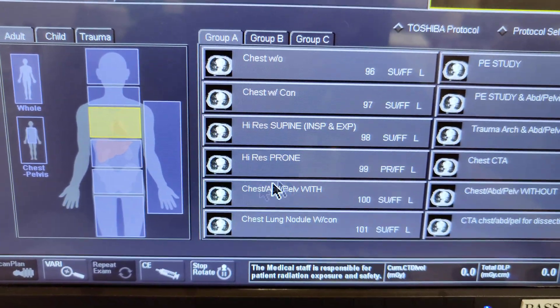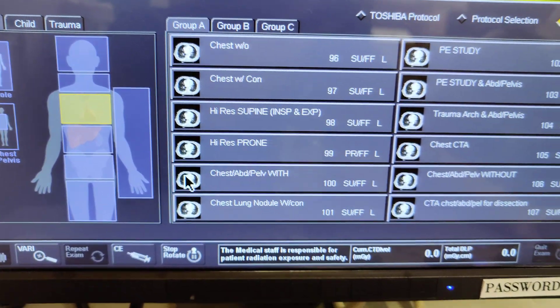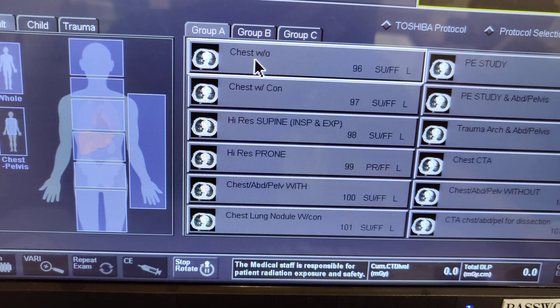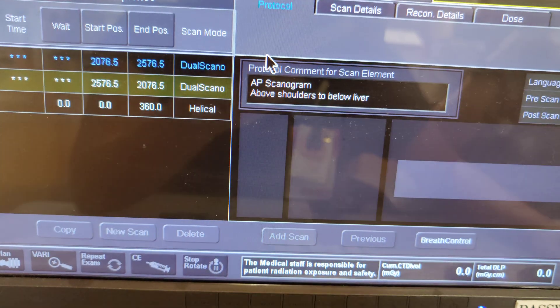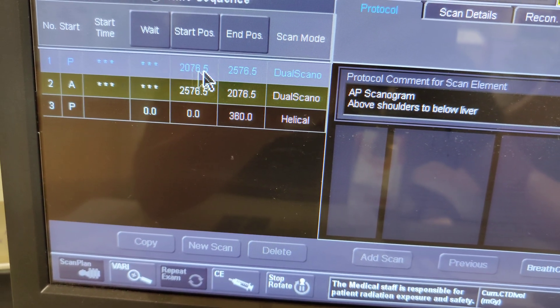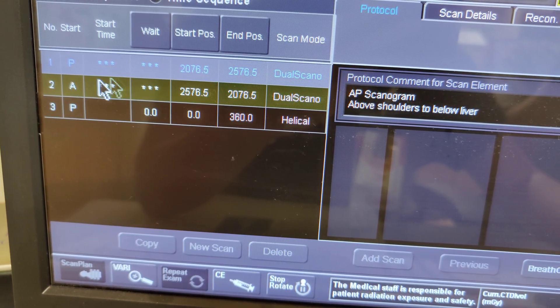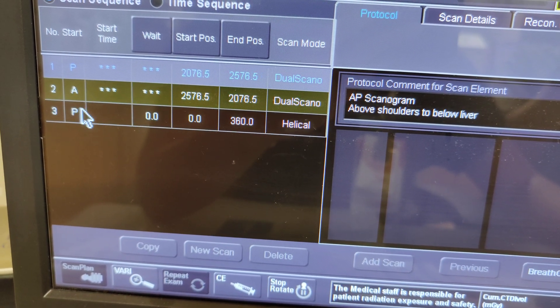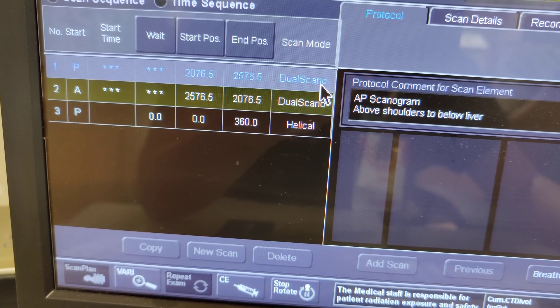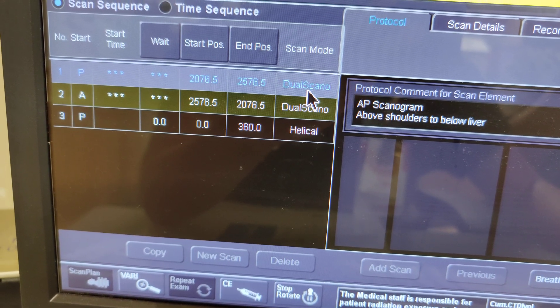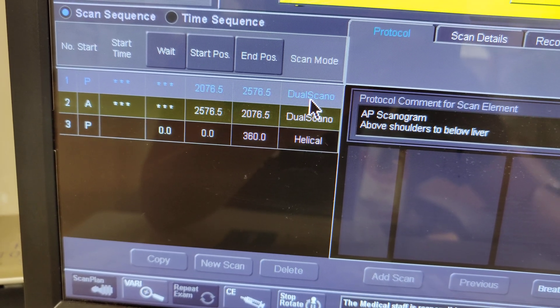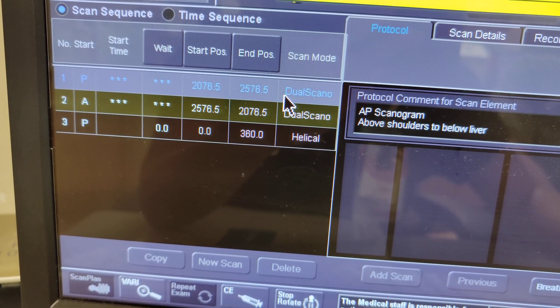Hello y'all, welcome back. I had a question about helical and volume scans, so let's start off with the basics. For a chest scan, once you start off you have three parameters that come up. The first one says dual scan, which means you're going to get a scout — just a view of what you're scanning.